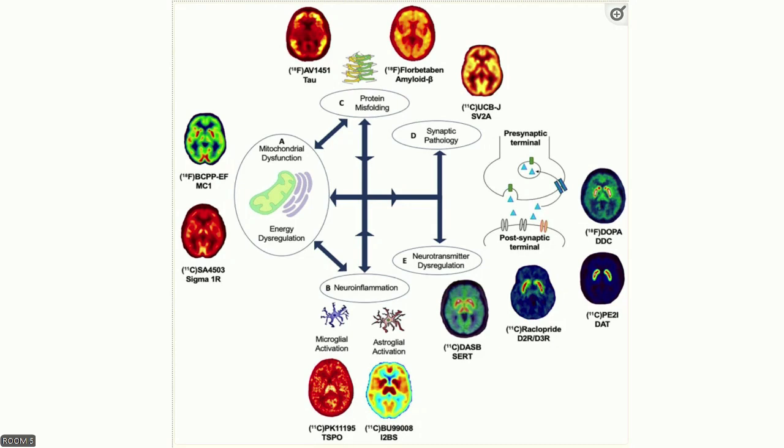You can see that depending on which tracer we use, we can assess different functions or dysfunctions of the brain, and also that each tracer accumulates quite differently also in the case of healthy subjects. I'll give you the example of F-DOPA, which is used to assess striatal depletion of dopamine, which happens in Parkinson's. So here you will see that this image will only capture the striatum, the subcortical structures, while other tracers accumulate also in the cortex.